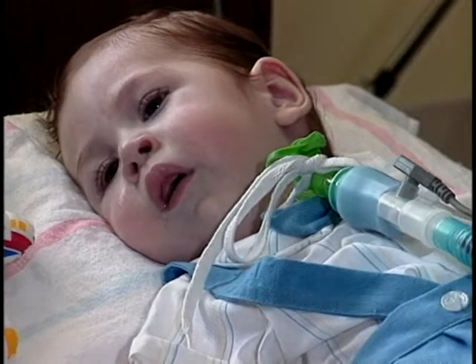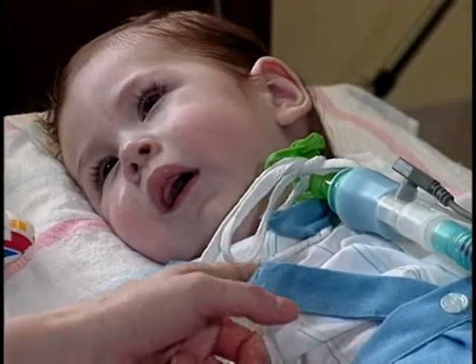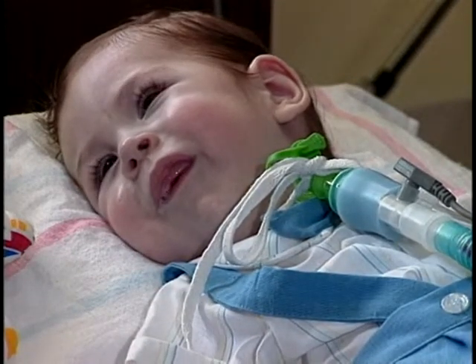And you can see that right now he's feeling the secretions in the back of his throat. And his level of respiratory distress isn't bad. I mean, he's just about the same as his normal respiratory rate. And he's enjoying himself. So that may not be some of the classical ways you would think of speech and language and some of the work you do, but it was incredibly valuable. You could tell he was just so proud of himself, and his mother loved it when she could come in and do that. And I think it just made his world a little bit different.